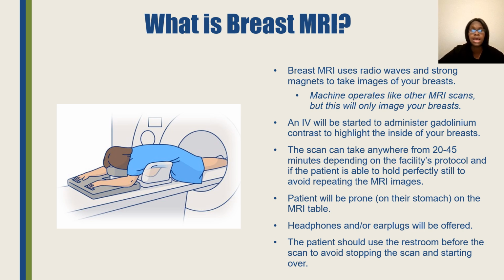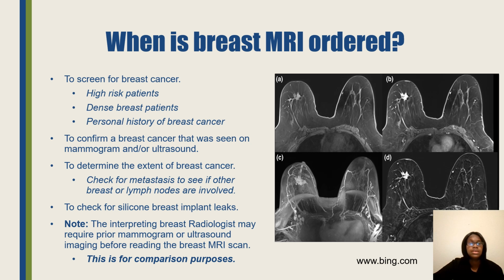Okay, with the breast MRI, the patient will be on their stomach. It will take about 20 to 45 minutes to perform. Images will be taken without contrast, and then we will take images with contrast. The patient will be given some type of earplugs or headphones because it will be loud. And a breast MRI is ordered if the patient is at high risk for breast cancer, has dense breast tissue, or has a personal history of breast cancer, or to check whether the cancer has spread to different areas such as the lymph nodes.